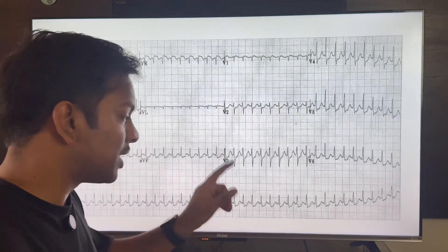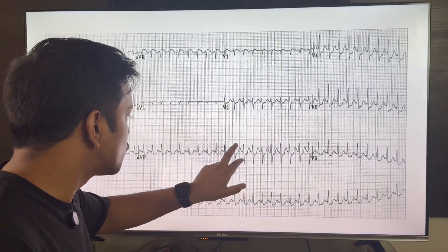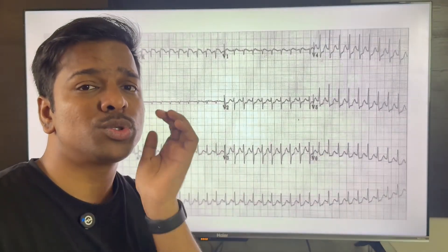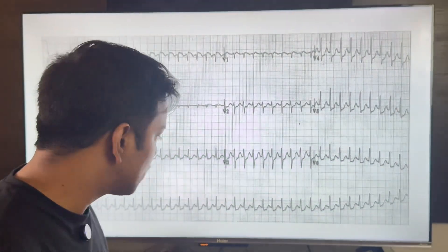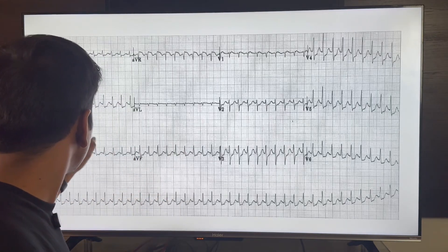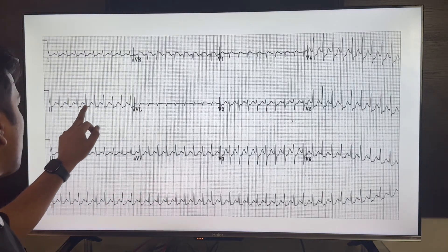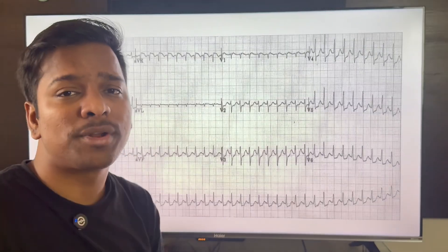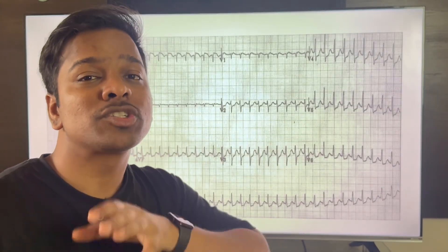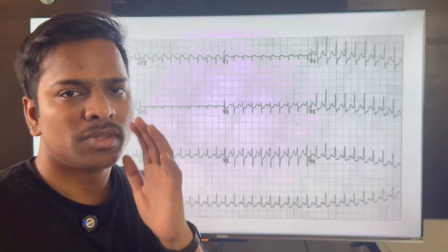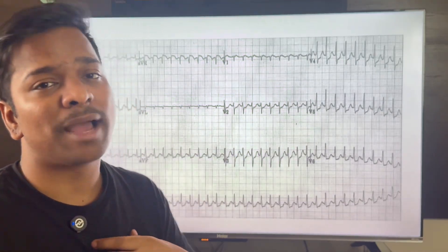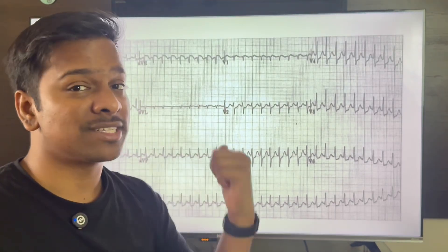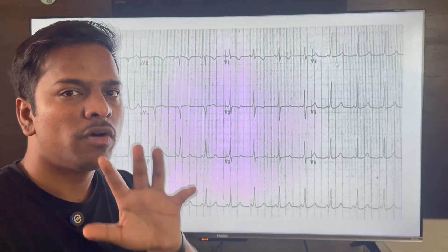In this ECG, 300 divided by almost one box gives a heart rate close to 300. P waves are not actually seen — they are embedded within the QRS complexes. This has to be supraventricular tachycardia. If the patient is stable — just walking around complaining of palpitations — you should do vagal maneuvers and adenosine. If the patient is unstable, cardioversion should be done.